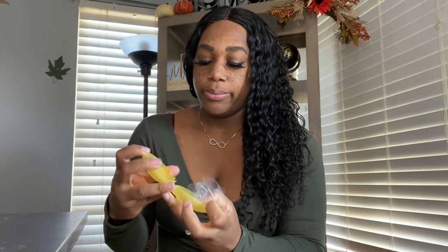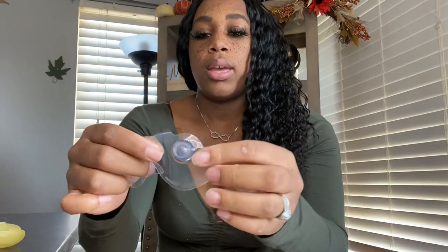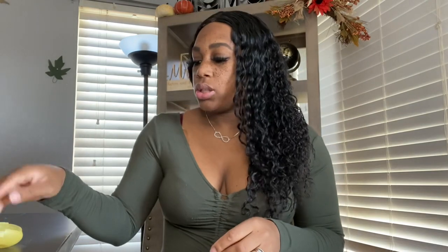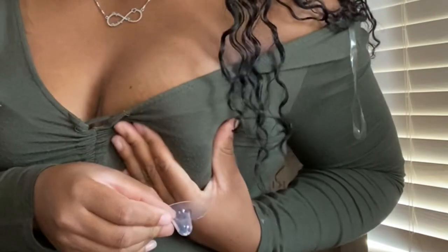First of all, this is the nipple guard that I have. It came in this cute case so that you don't lose them, and it came with two. They look like this and they're half cut. So I'm going to show you how to put them on. What you want to do is grab your boob and squeeze milk into it. Squeezing your milk is going to lube it up — your milk is the best lubricant.